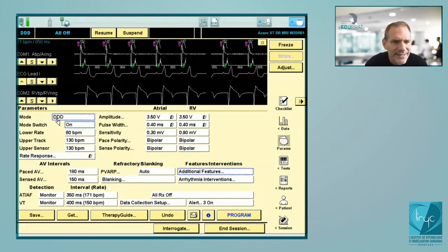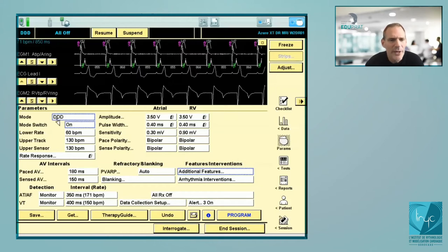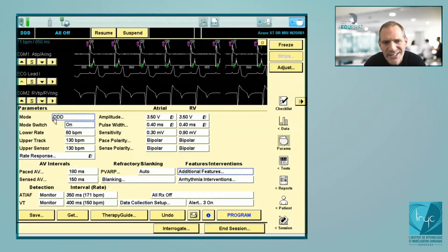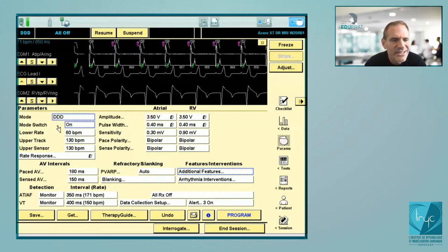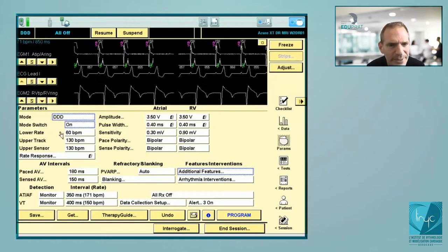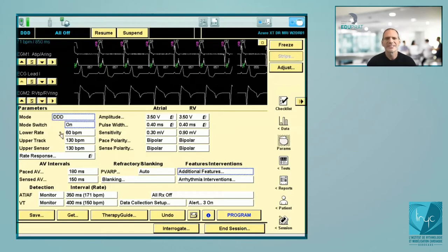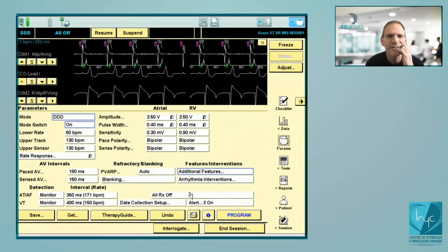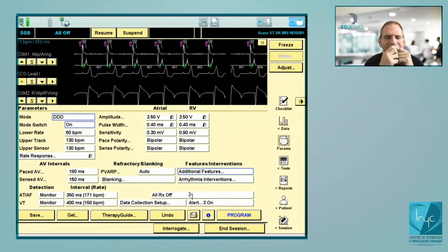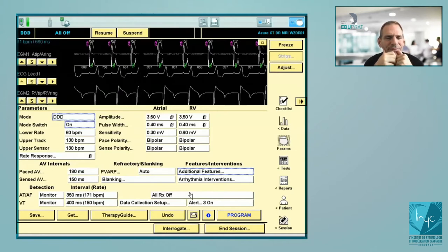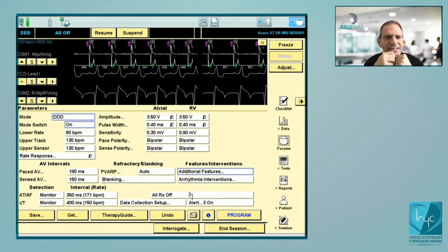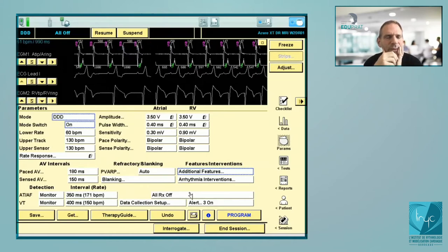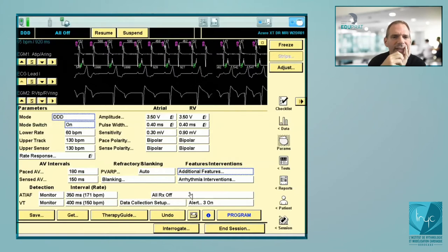This is a simulator showing the nominal programming: DDD, mode switch on, lower rate 60 bpm, upper tracking rate 130 bpm. We're going to simulate a sinus tachycardia — an acceleration of the atrial rhythm. You see acceleration, acceleration, and at one point the atrial rate becomes faster than the upper tracking rate.